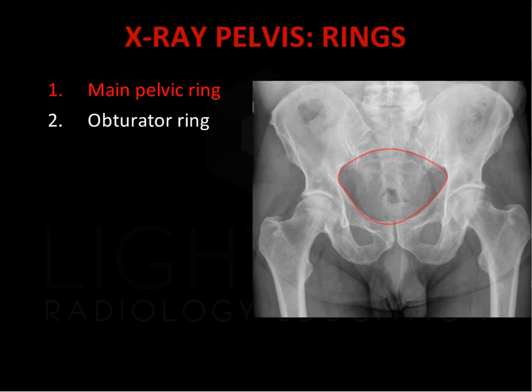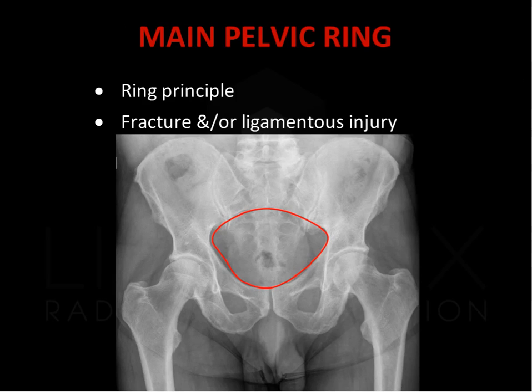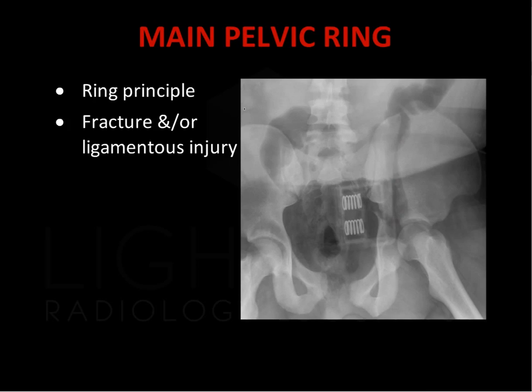The first pelvic ring to assess is the main pelvic ring. This is formed by the inner margin of the sacrum, iliac, and pubic bones, as well as the sacroiliac joint and pubic symphysis. This case demonstrates a fracture of the main pelvic ring involving the left iliac bone and acetabulum. The second injury to the ring is disruption of the pubic symphysis, known as pubic diastasis.